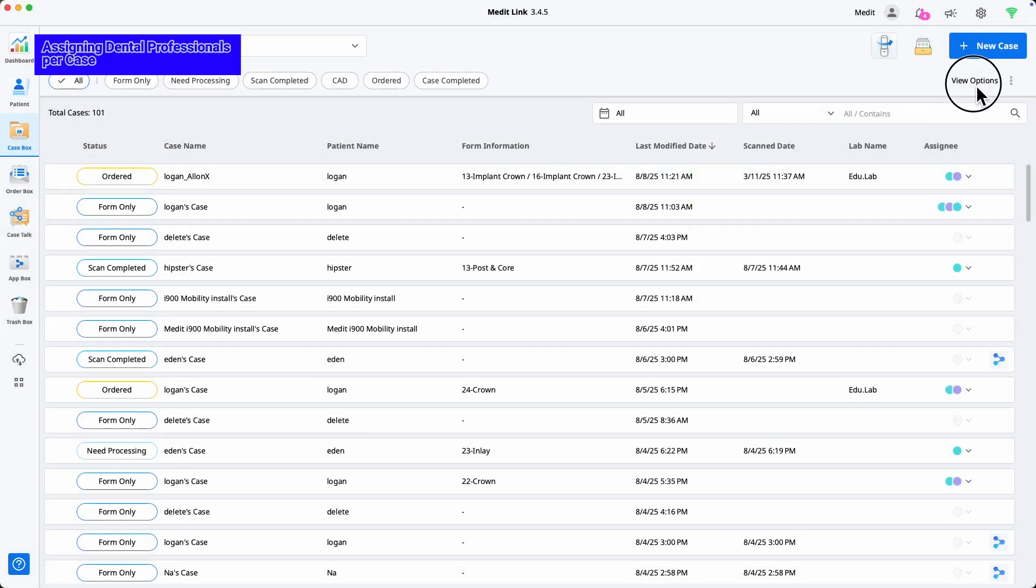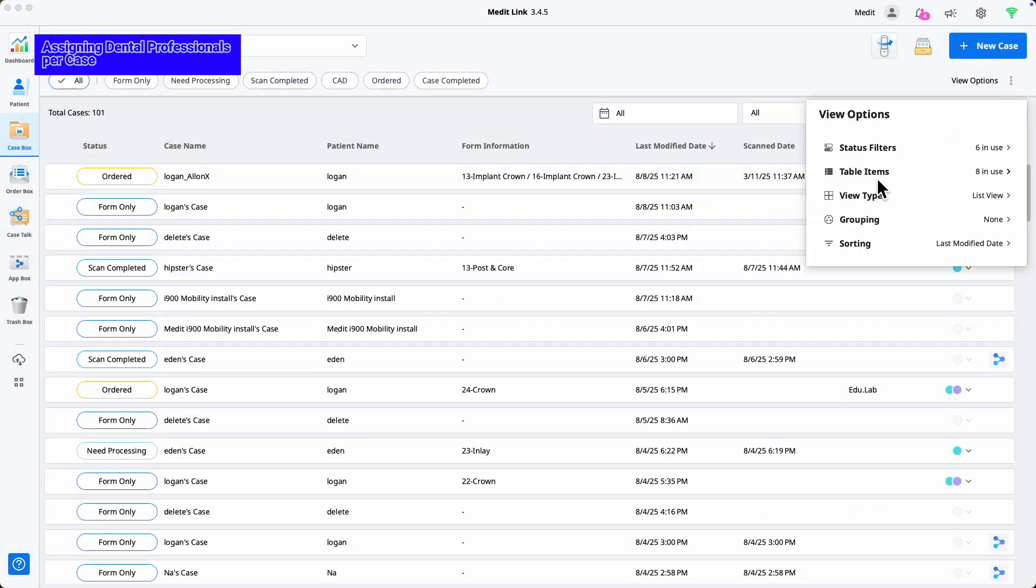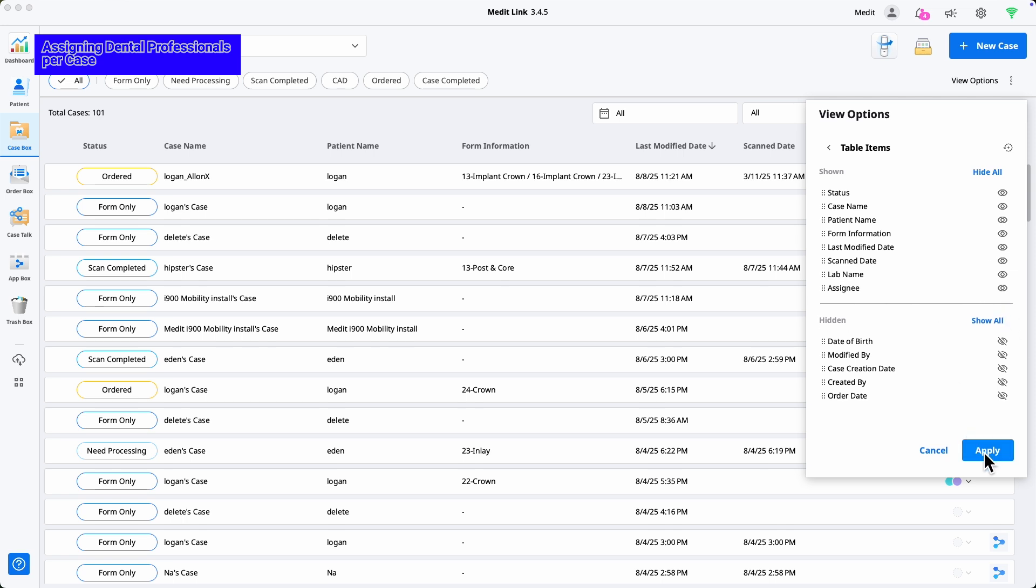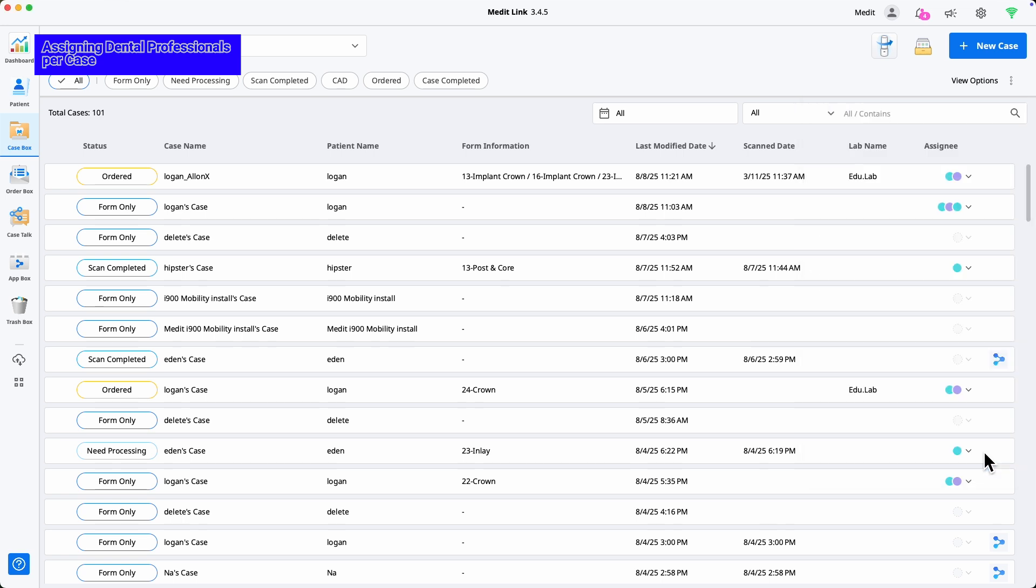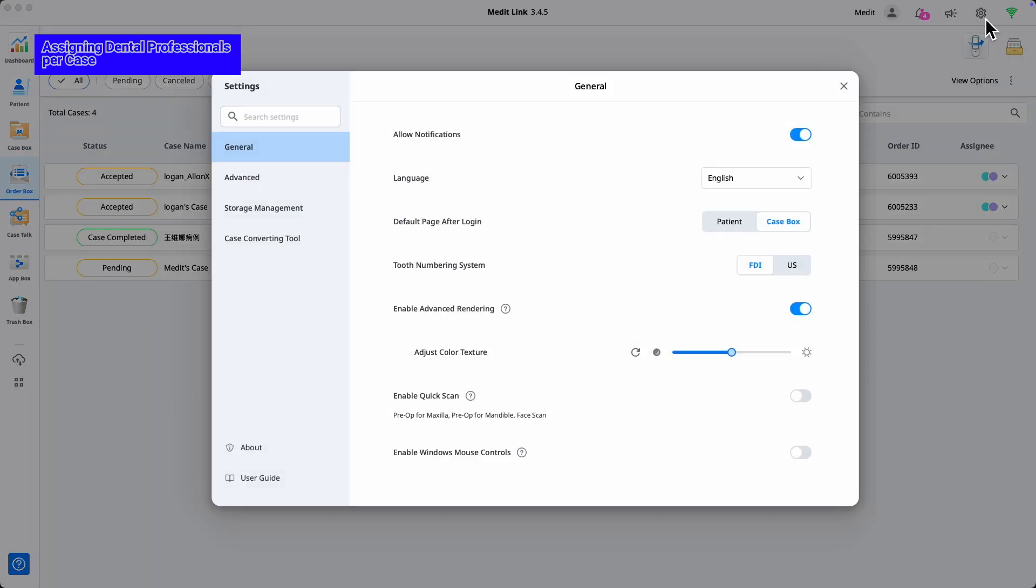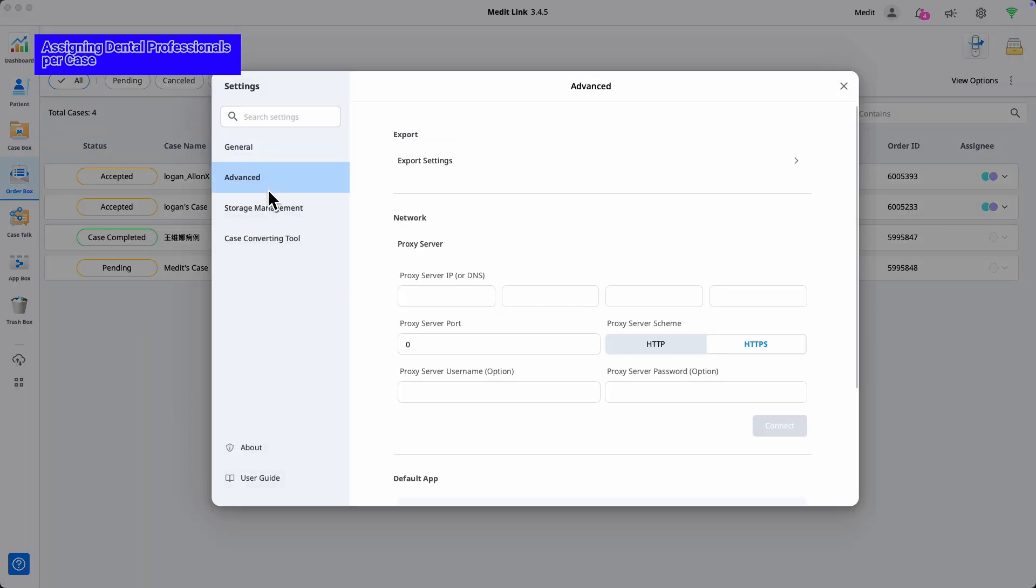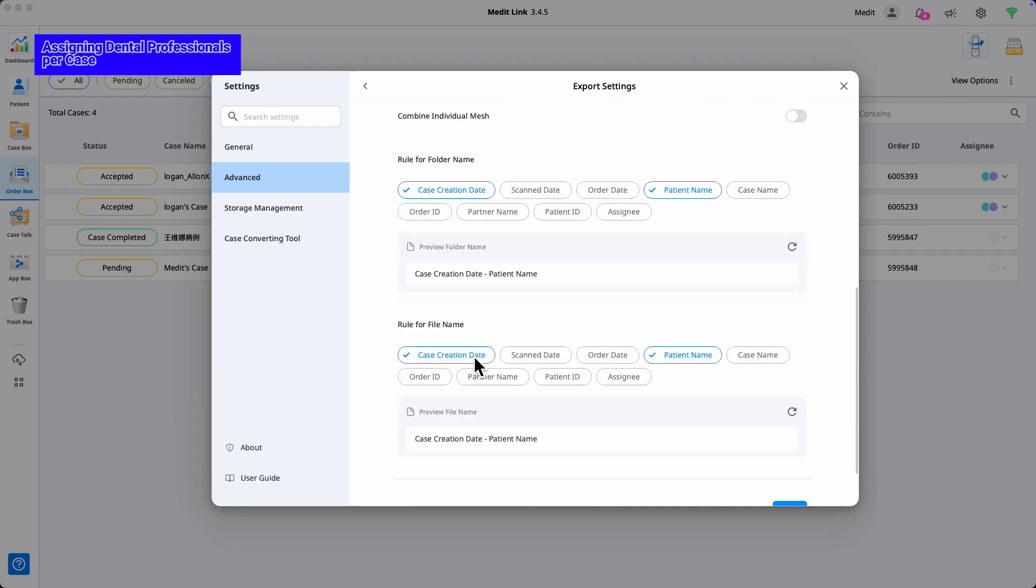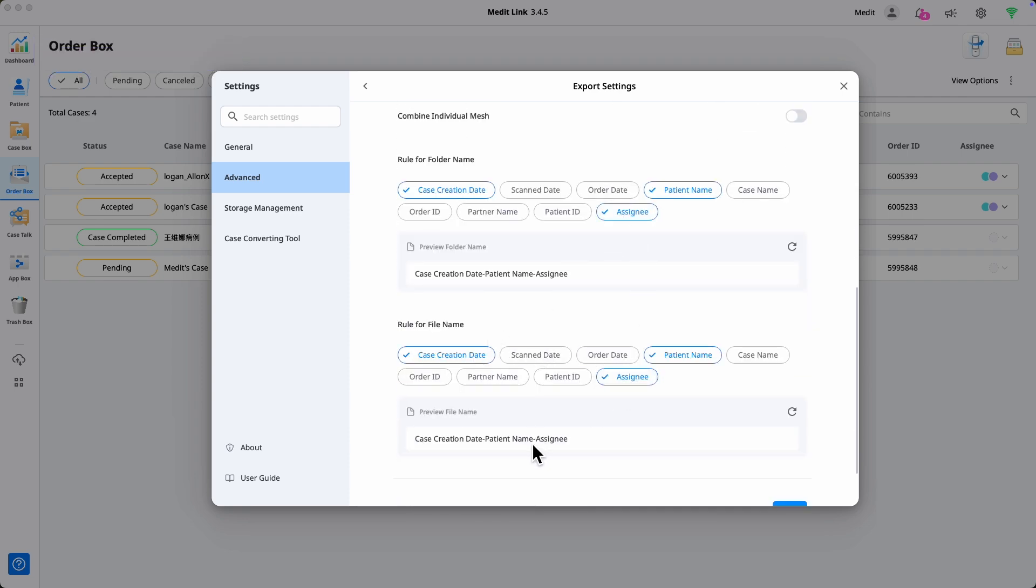In the case, order, or work box, enable assignee in the view options to see the assigned person in the list. You can also check the assignee in the case details. In the export options under settings, you can include assignee in the folder and file naming rules. Assign the right people to keep your teamwork on track.